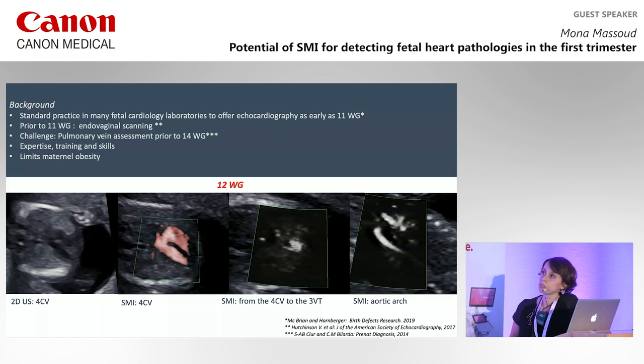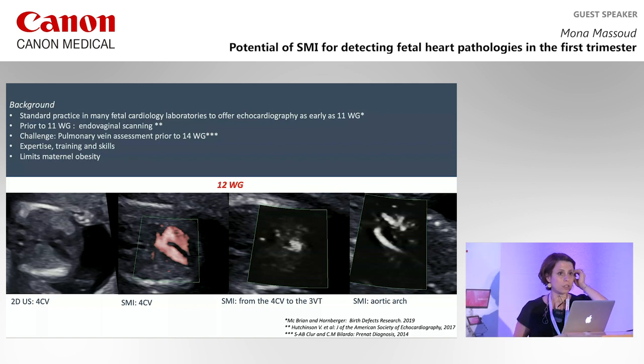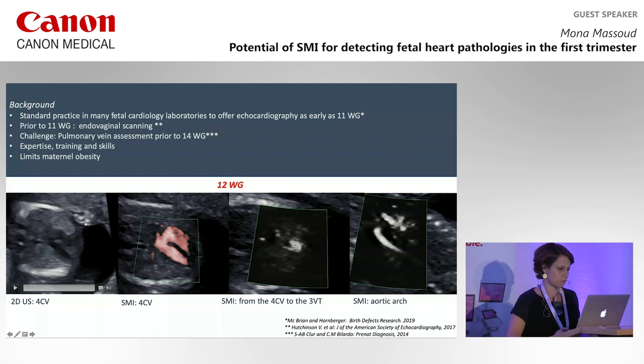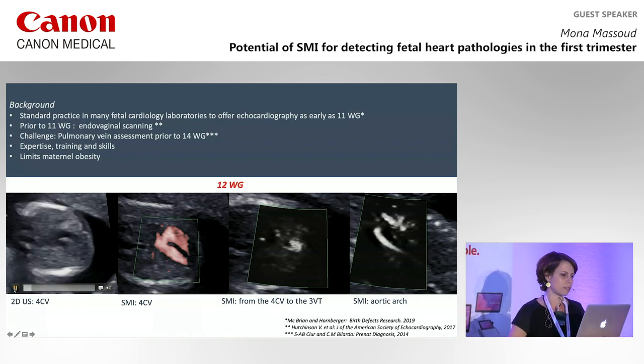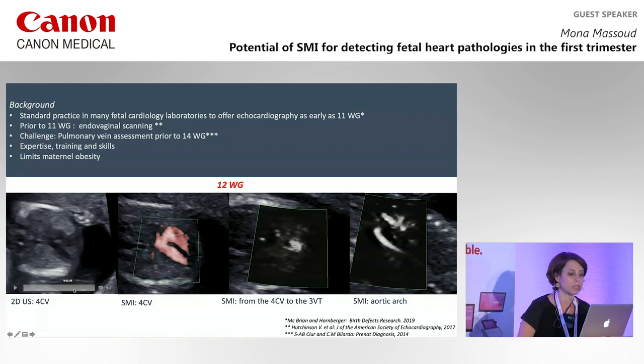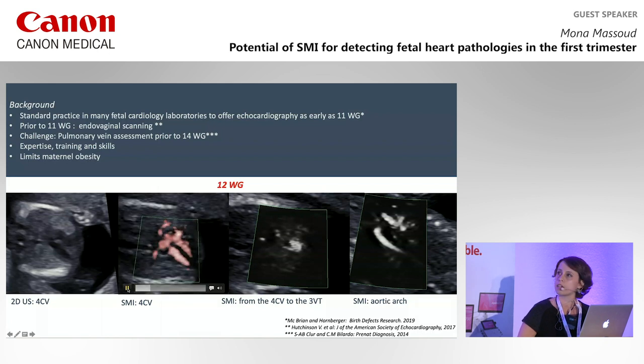And this fetal ultrasound echocardiography needs some expertise and training and skills of the trainer. And the limit is the maternal obesity. So as you see right here, this is a normal 2D ultrasound of the four chamber views. We can see the four chamber views, but when we use the SMI, we have a better visualization of these four cavities of the heart.